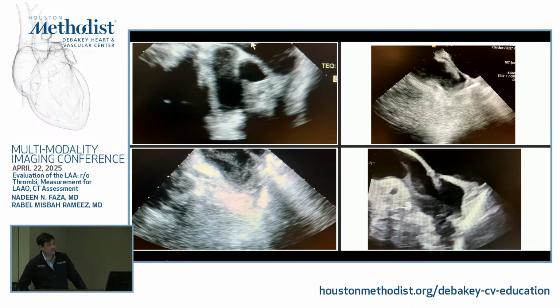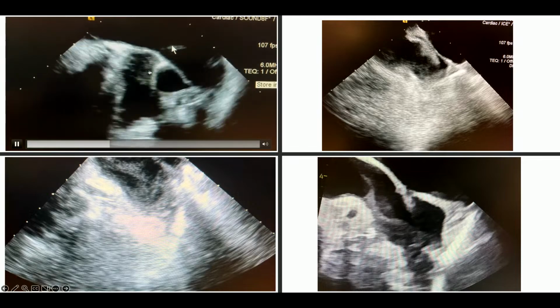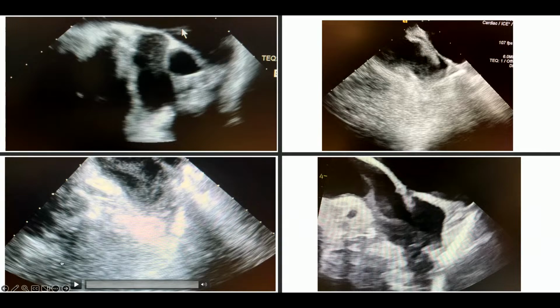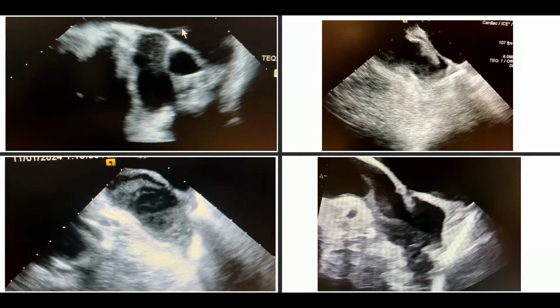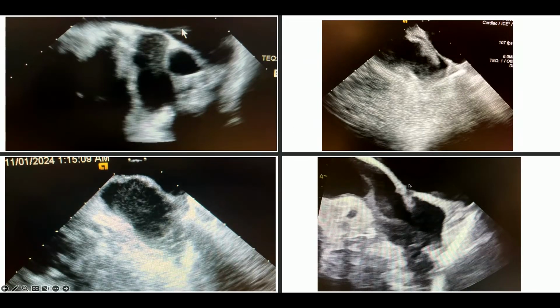Can we see clots? Yes. This is a view from the PA. I'm gonna show you really quick. So as you can see right here, we believe it is a clot. The TEE was inconclusive, so we went in and we went into the PA, and we were saying this is obviously a clot formation. You're taking a look from the pulmonary vein, and these are two still pictures that you can see from the pulmonary vein that you can see the tip and the body with clot.